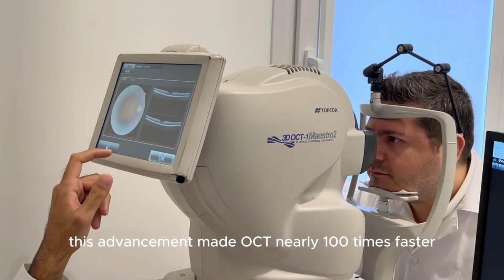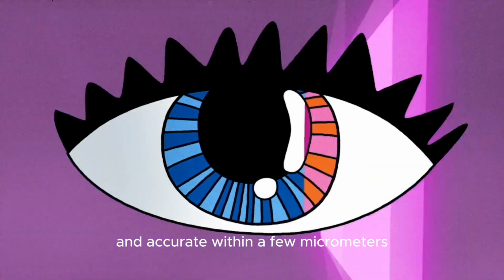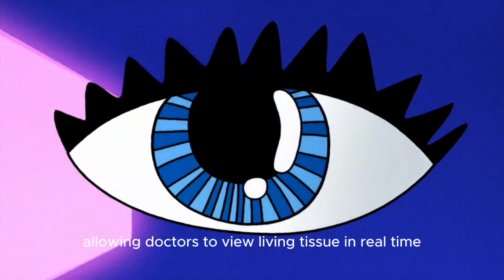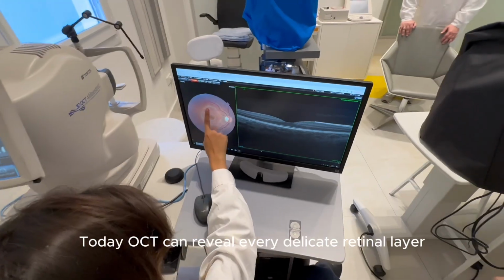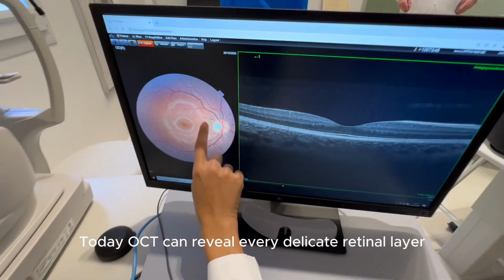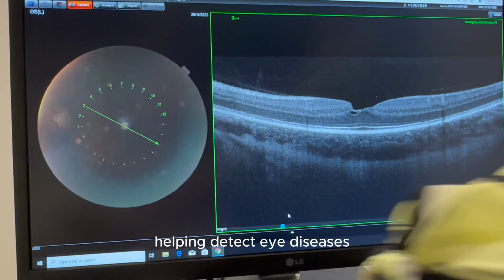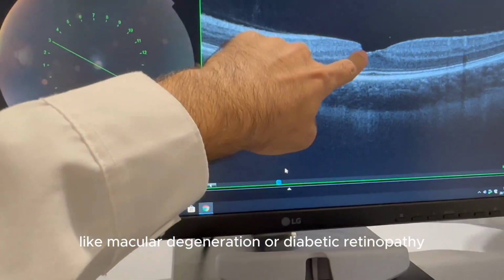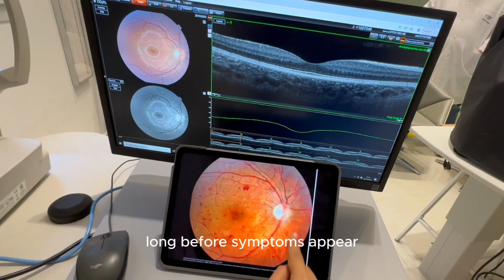This advancement made OCT nearly 100 times faster and accurate within a few micrometers, allowing doctors to view living tissue in real time. Today, OCT can reveal every delicate retinal layer, helping detect eye diseases like macular degeneration or diabetic retinopathy long before symptoms appear.